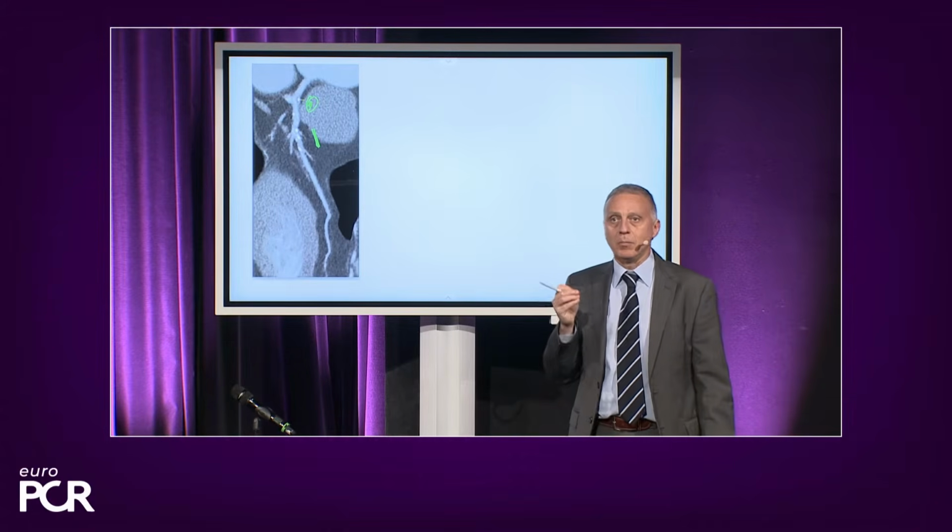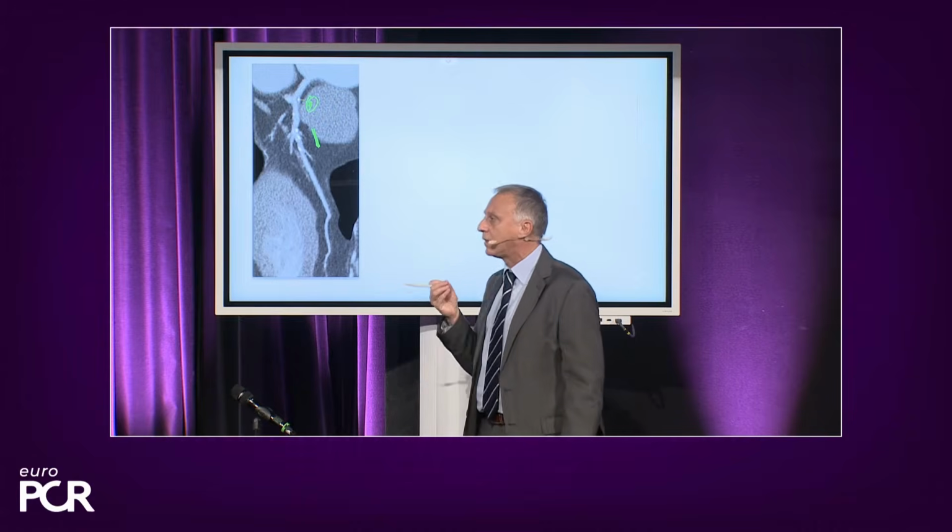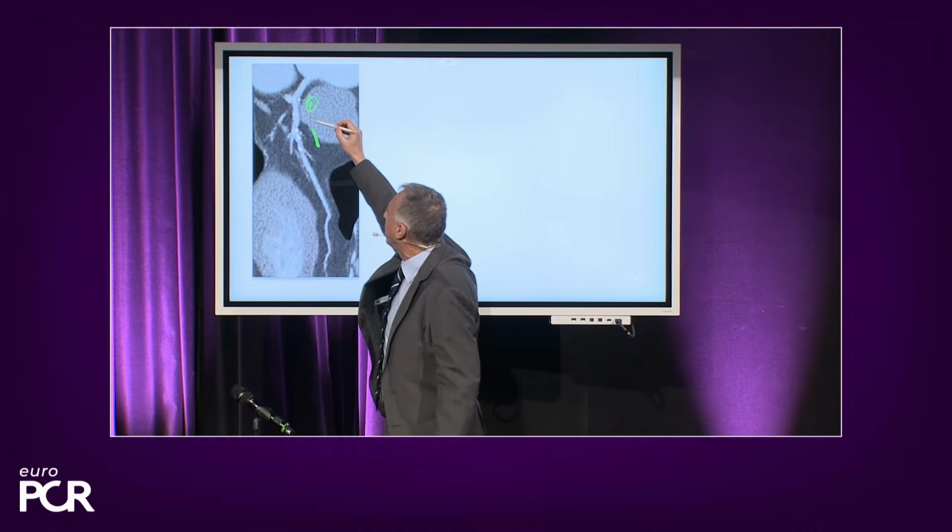And we have definitely also some disease at the level of the left main. In between, with CT scan, which is quite sensitive as a way of assessing atherosclerosis by imaging, we see that there is an area where we have doubt about the presence of important disease.